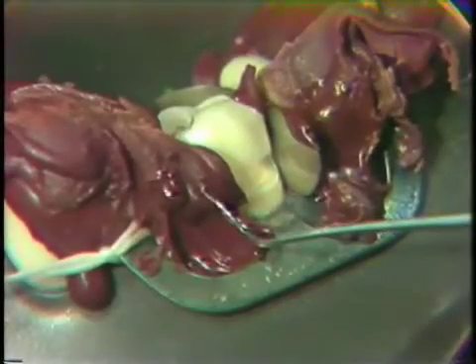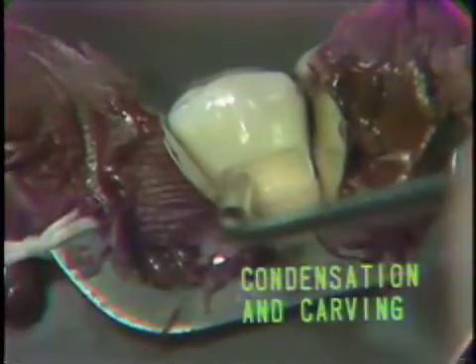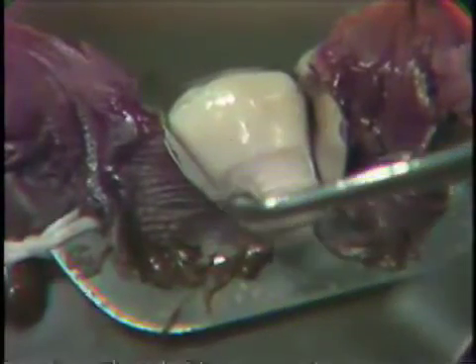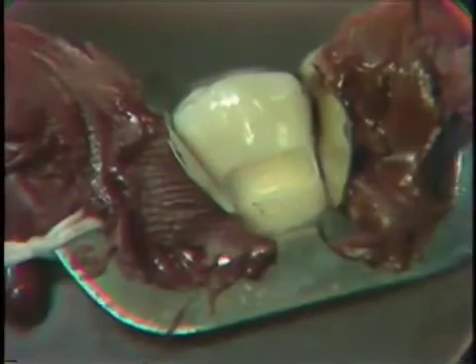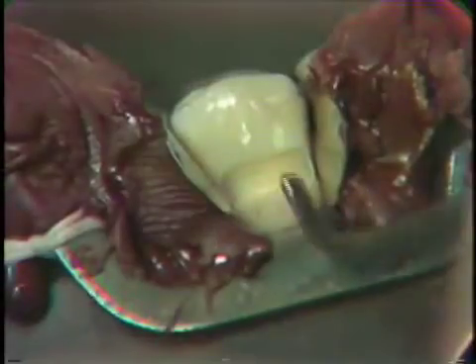At this point we are ready for our packing. Note that our matrix is in place extending out buccally, supported by compound that has been wedged. Prior to condensing our amalgam, it is advisable to pretest our condensers. We are using a Wesco plastic instrument that we will use at the beginning of our packing. We will also test our other condensers — a more elliptical condenser and then a larger condenser.